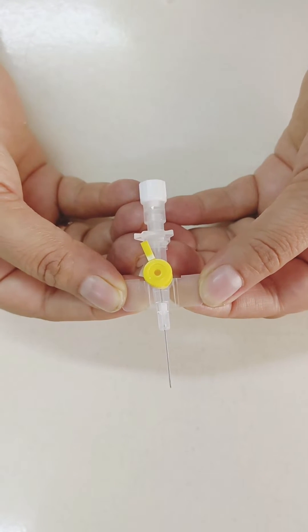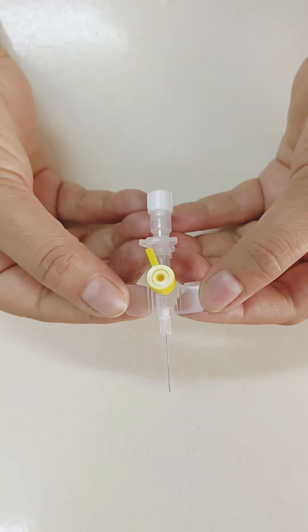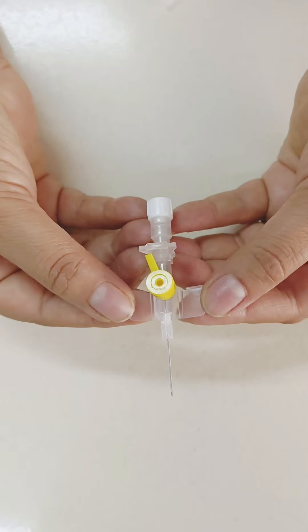These are catheter wings. It helps to fix the intracath.